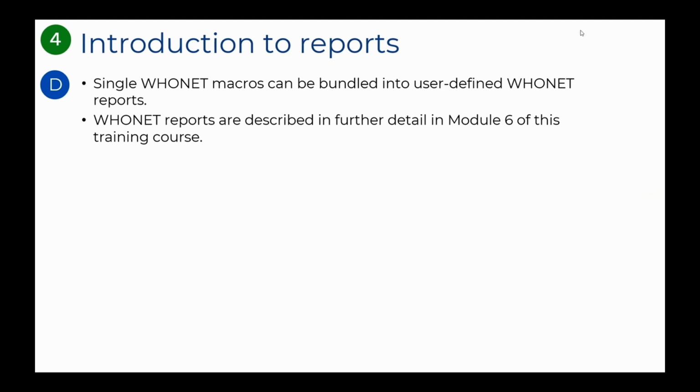Introduction to Reports. In this module, you have seen how to create individual WHONET macros. In Module 6, you will see that we can bundle many analysis macros into a single user-defined report to have one report that does many different analyses.